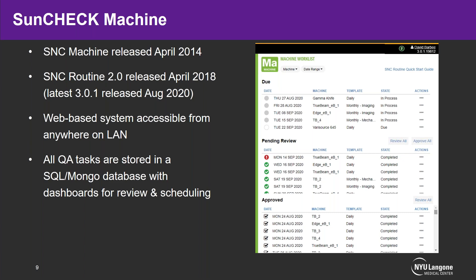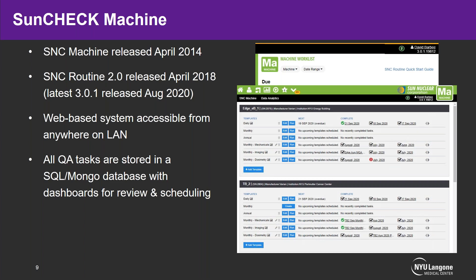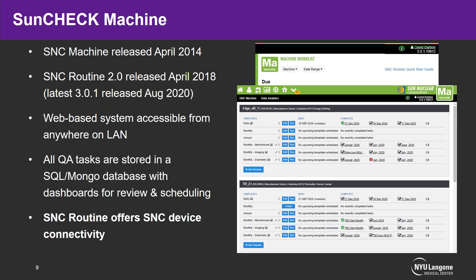SNC Routine is a web-based system accessible from anywhere on your local area network. All QA tasks that are set up and recorded are stored in a SQL or Mongo database, with dashboards available for review and scheduling. On the right you can see the machine work list — the homepage — where we have tasks that are due, those pending review by a physicist, and those that are approved. We've broken up our monthly tests into mechanicals, imaging, and dosimetry. SNC Routine also offers SNC device connectivity with some of their products.